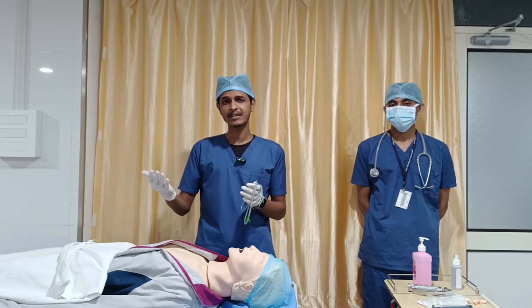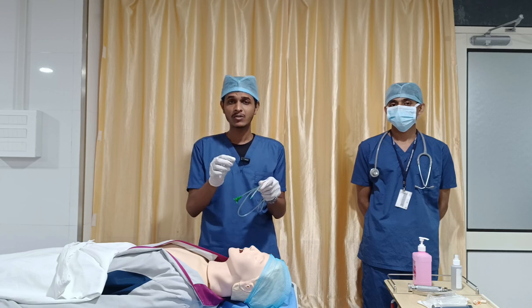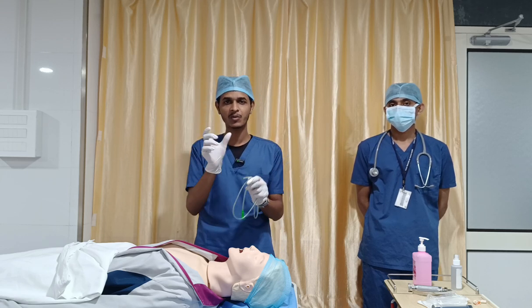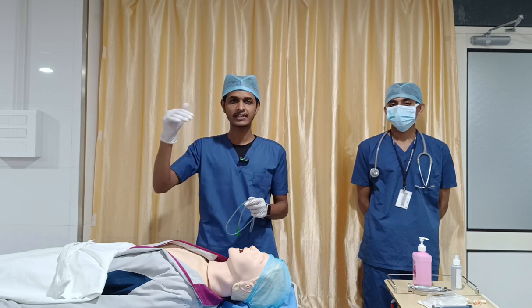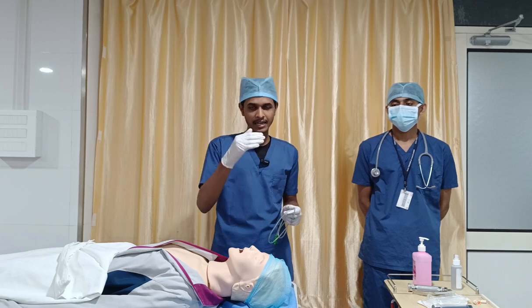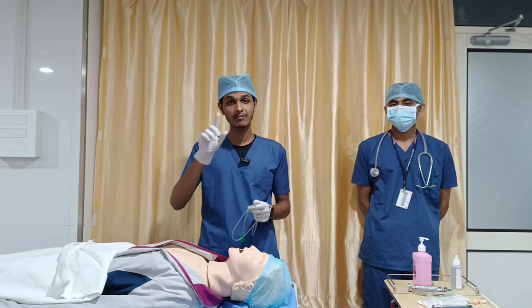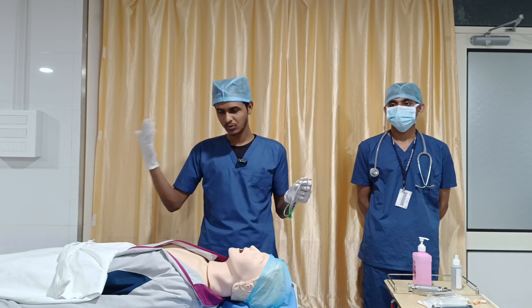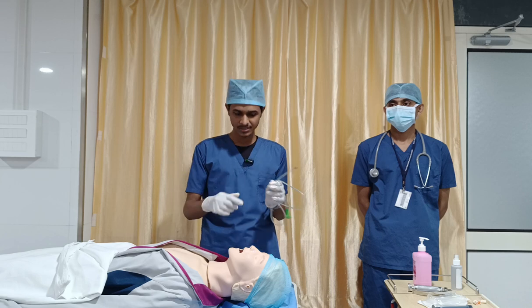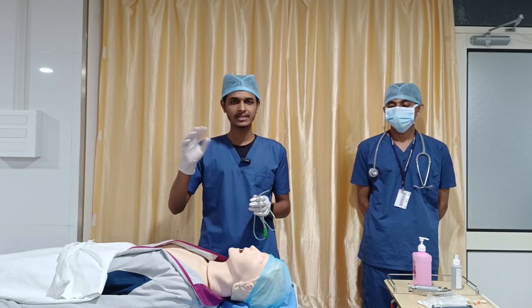Some other people mention that if you insert around 50 to 55 centimeters in an average adult or average body build, that will also reach your fundus region. And one more study mentions the same thing, tip of the nose to the earlobe to the xiphisternum plus 5 centimeters. So again, a lot of calculations are there. Better you choose the tip of the nose to the earlobe to your xiphisternum plus 10 centimeters.